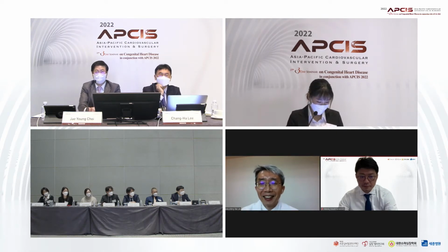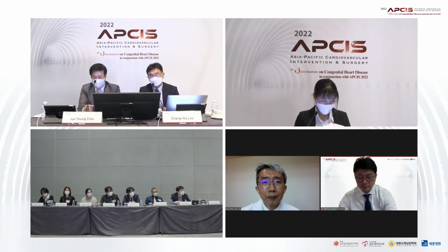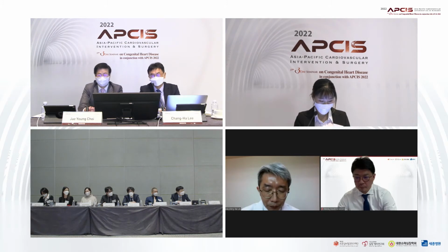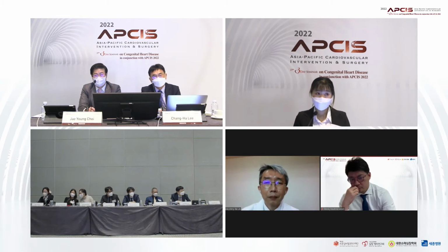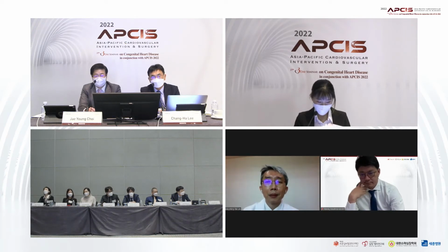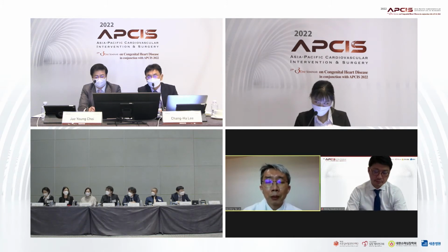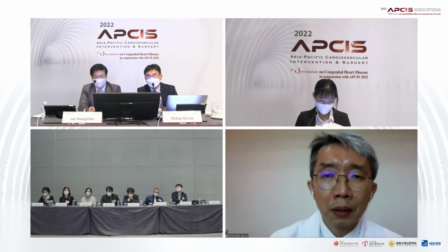I don't know about Taiwan's results in this substrate surgical outcome, but in my experience, the surgical outcome in this kind of patient was very poor, especially after the first palliation. So in my opinion, we wanted to get past the first shunt or banding palliation in addition to the definitive surgery. So that was our objective at first. My surgeon colleagues recently reviewed our surgical results during the recent 20 years.